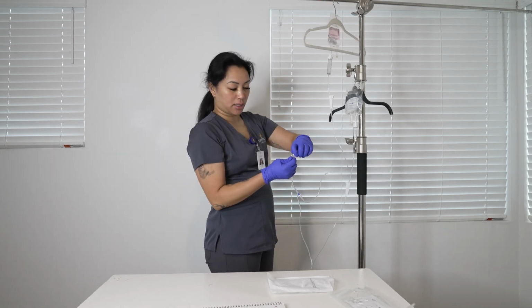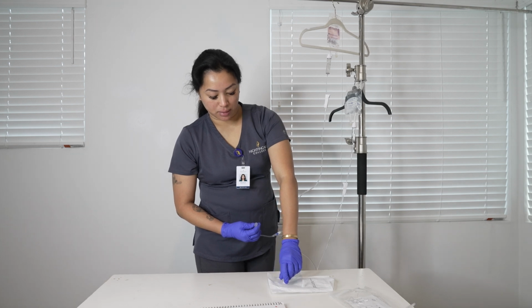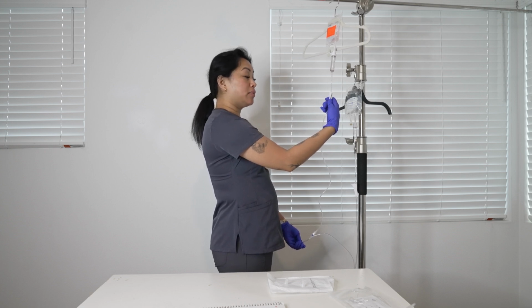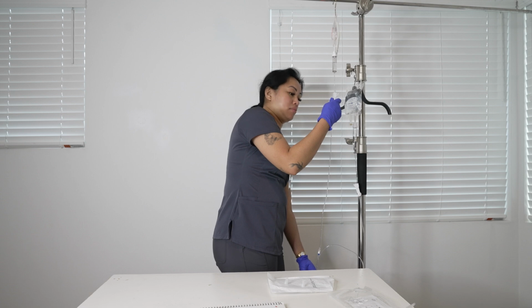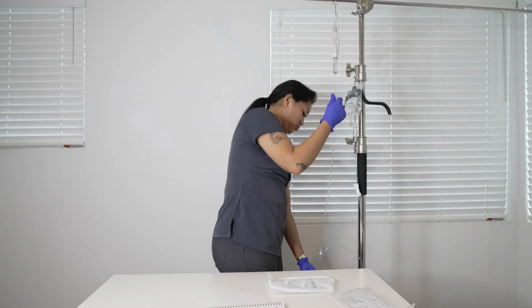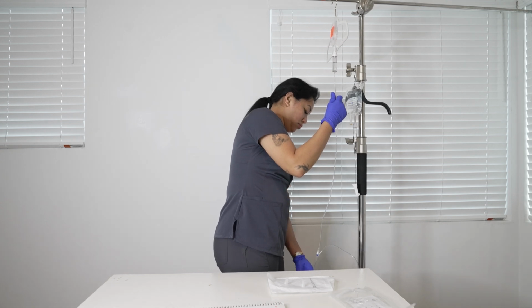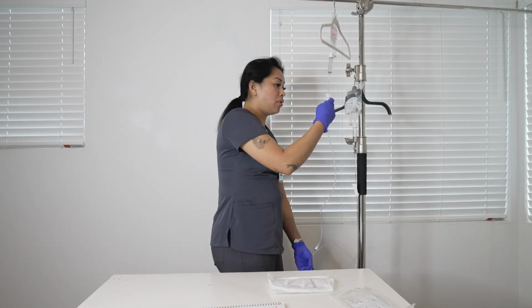So I'm going to uncap the adapter here to the patient, put that on a nice clean flat surface, and then now I am going to slowly unroll the roller clamp from the secondary tubing from the amoxicillin to take out any air bubbles.